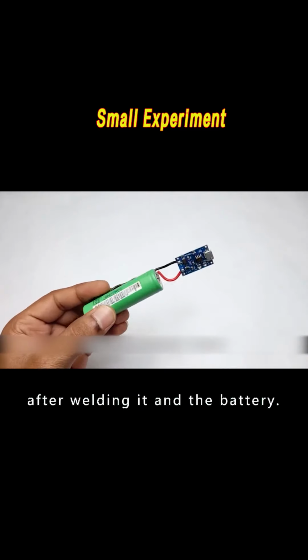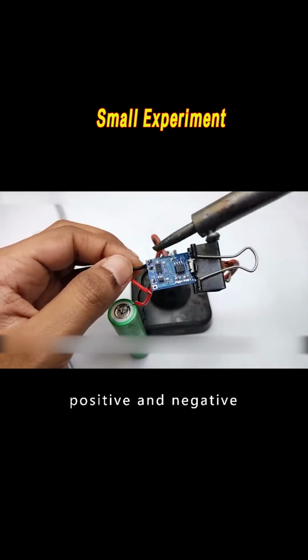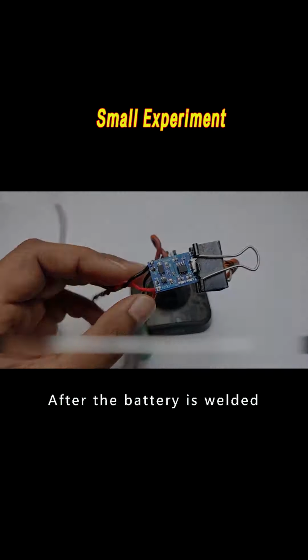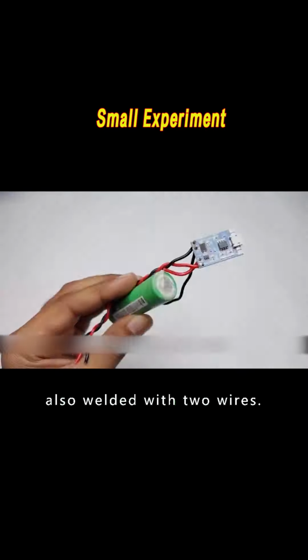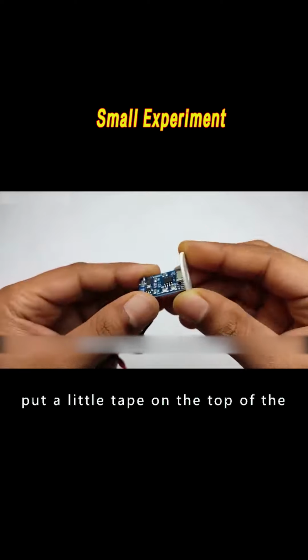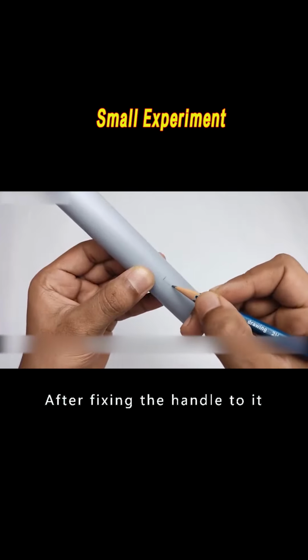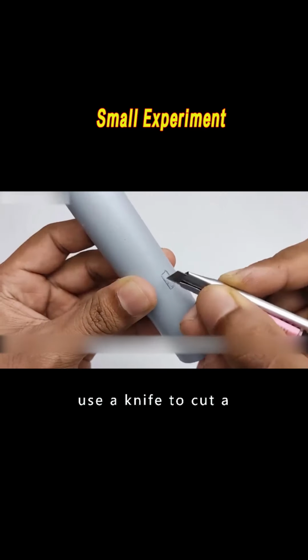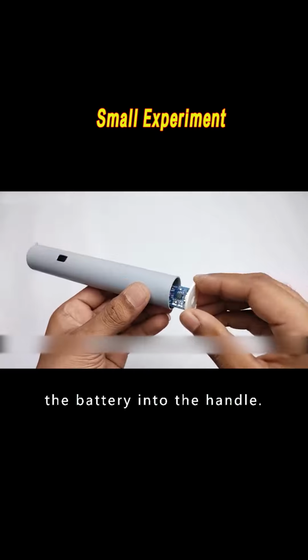After welding the wires and the battery, when you weld here, you have to distinguish between the positive and negative poles and the welded ends. After the battery is welded, the load output port is also welded with 2 wires. Once you've done that, put a little tape on the top of the battery and attach the charging port to the base. After fixing the handle to it, use a knife to cut a switch hole in the handle, and then you can put the battery into the handle.